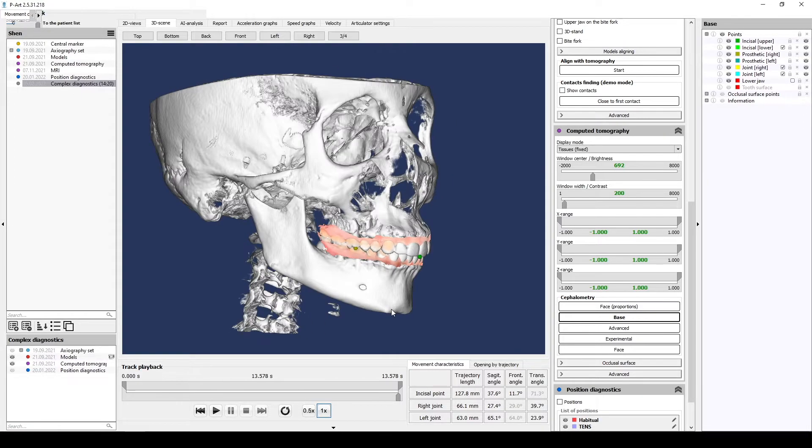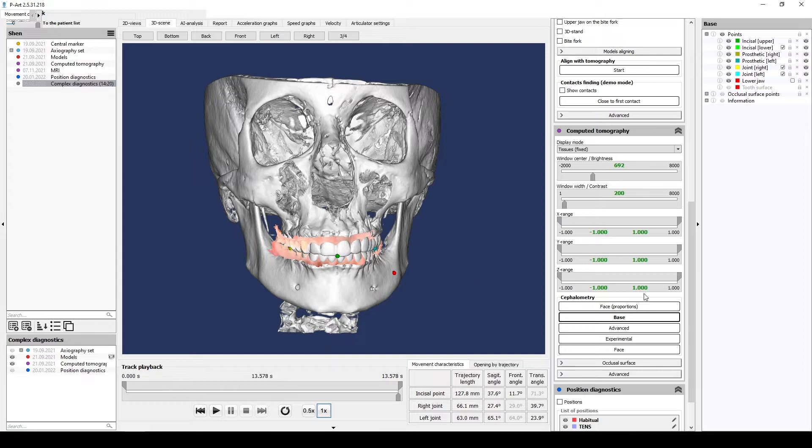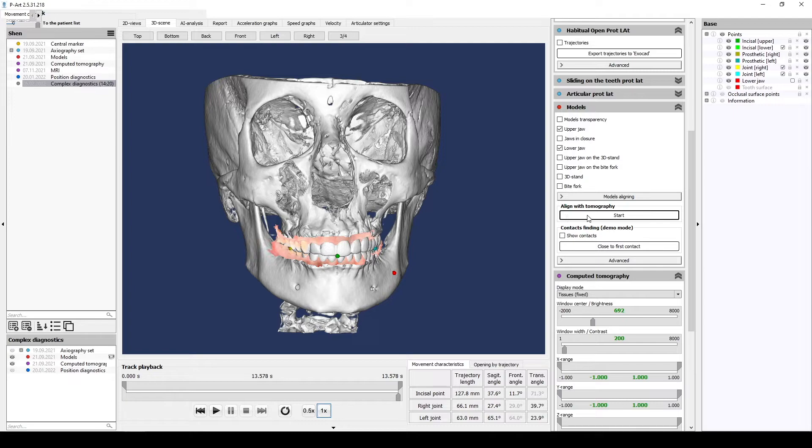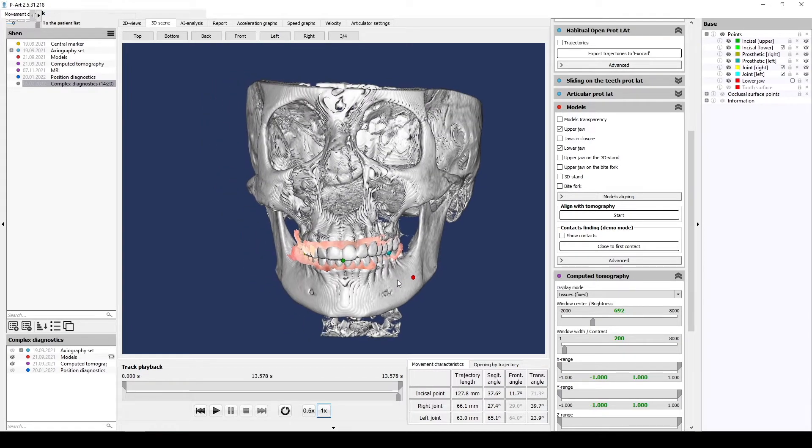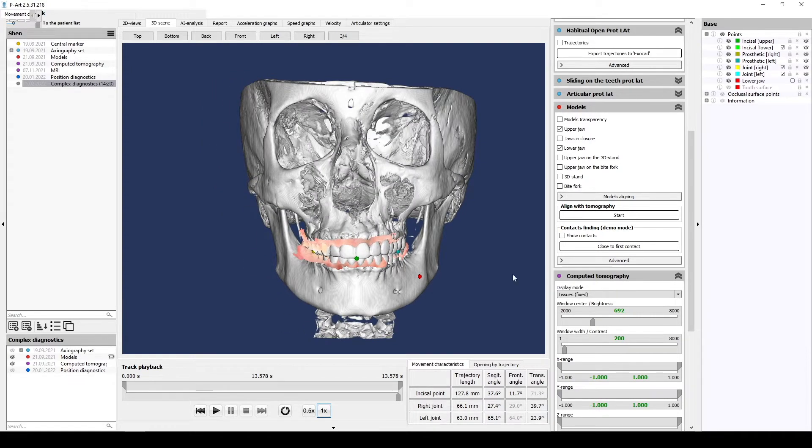On the left bottom side of the menu, we make individual models visible, but they are not aligned. To align them, we go to the individual models section on the right side of the menu and find align with tomography.